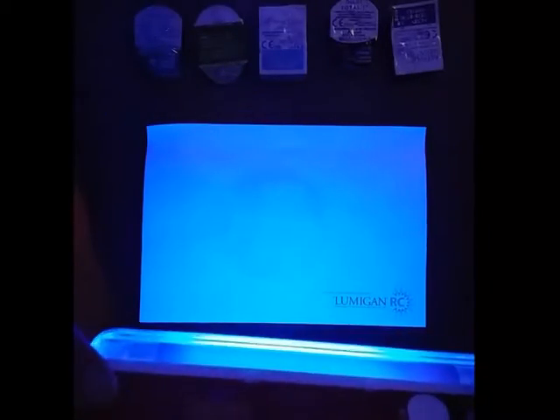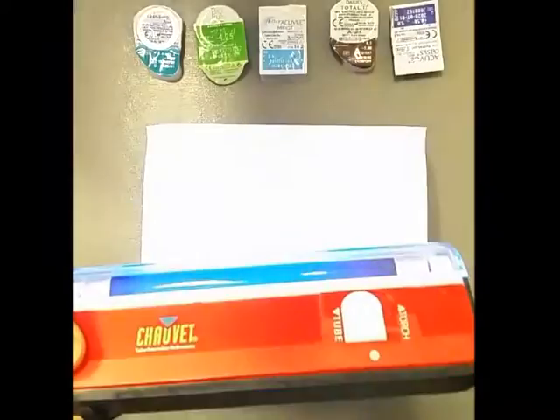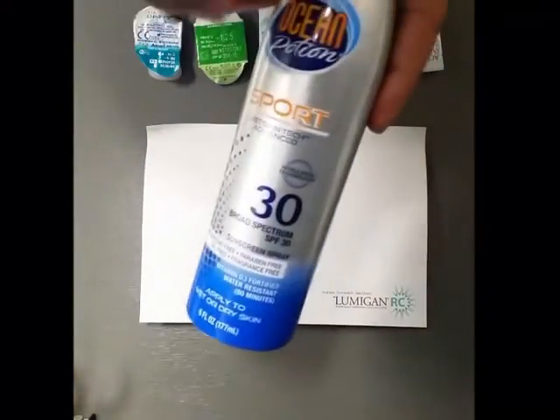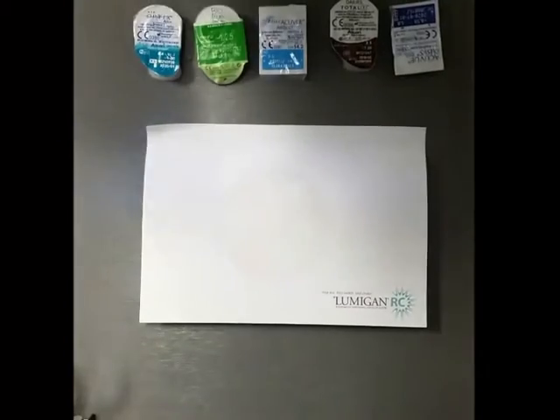So it actually glows, and what this is doing is it's reflecting UV light. I'll also use an SPF 30 sunscreen and we'll see what that does to the UV exposure, just as a control test.